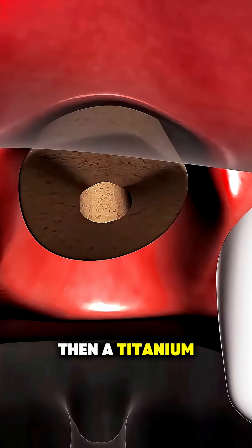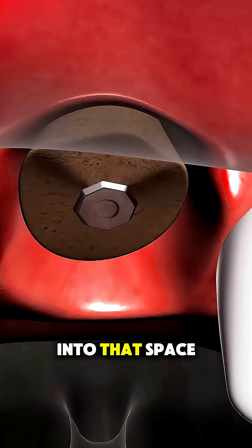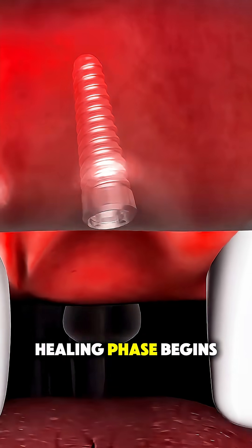Then, a titanium implant — basically an artificial tooth root — is placed snugly into that space. The gum is closed over it, and now the healing phase begins.